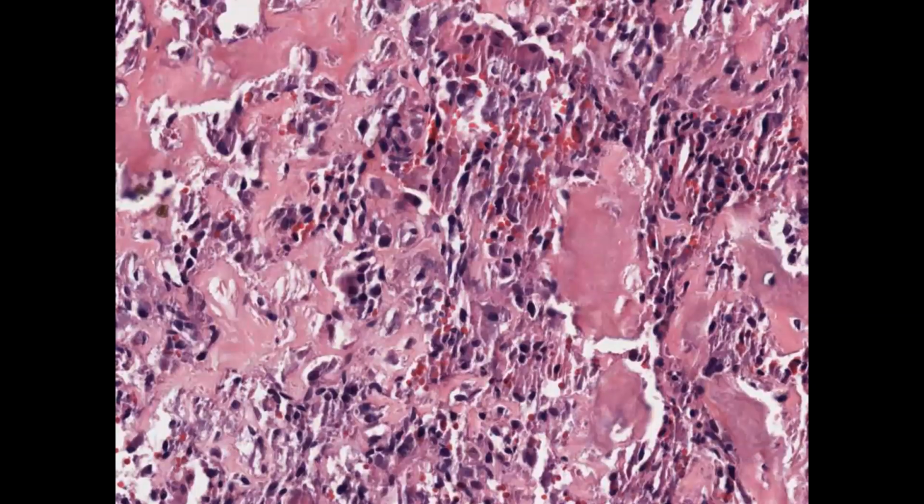And here's an example of what the histology might look like for that, where you get nice osteoid formation, very cellular, some admixed giant cells. But we're not seeing a high degree of anaplasia here. We're not seeing a lot of atypical cells. And we'll get to those criteria, and you'll see more of these when you hear Dr. Tran's lecture later in the month.